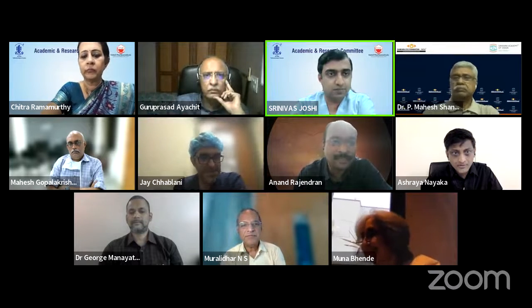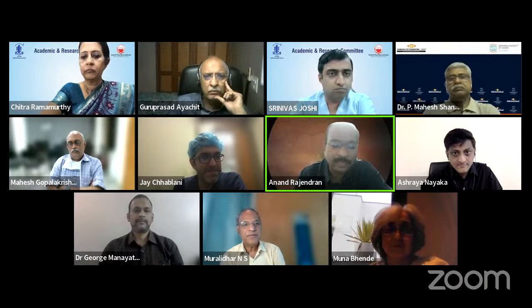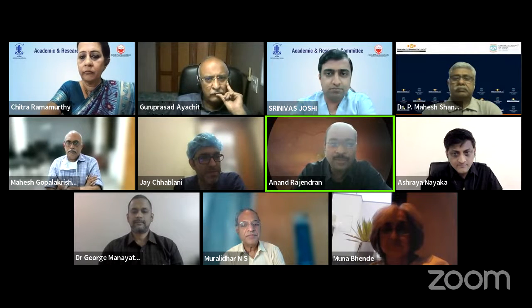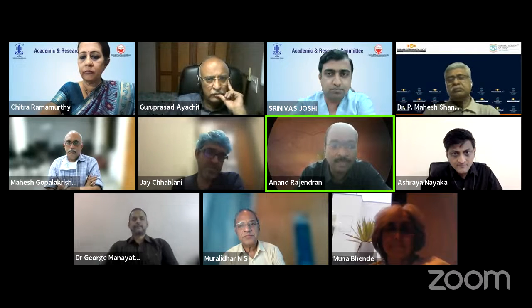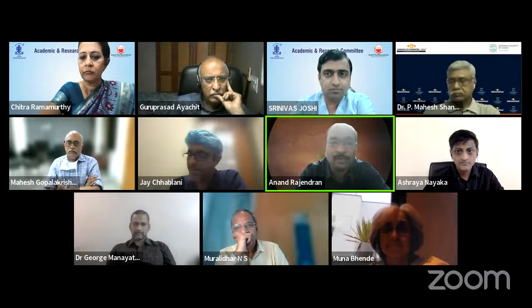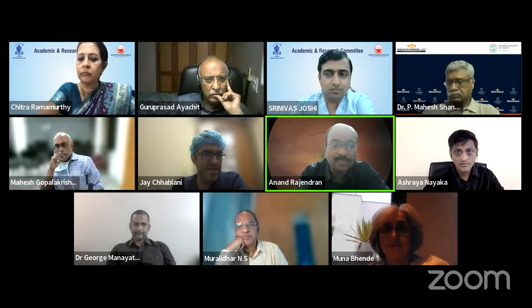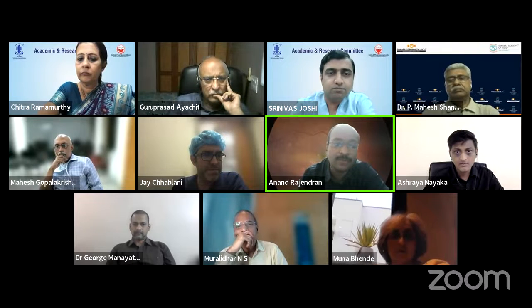Yeah, Jay, again, fantastic presentation. Always wonderful to listen to you, especially on CSR. I just wanted to know, again, with that same case, given that experience, when you have a senior patient, post CSR that you feel has regressed or is stable, and you have this network lying quiescent there, do you actually follow up regularly and look for those pruning small vessels, like the way we try to do in AMD cases? You actually try to look back and see if there's an increase in those small little pruning vessels.